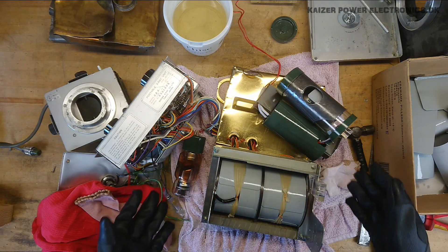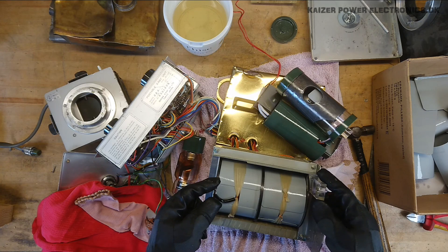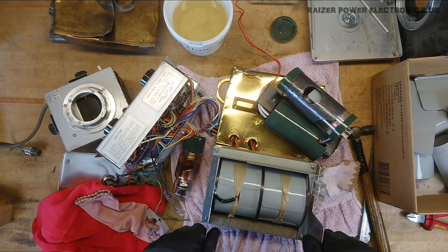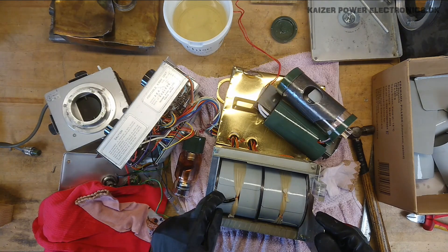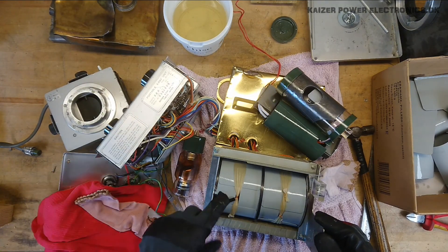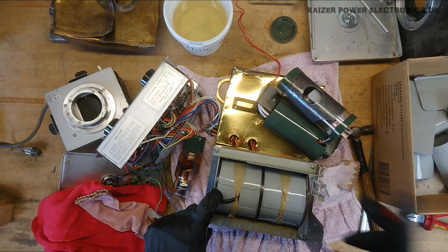I really hope you enjoyed seeing this teardown of this complete portable x-ray system from Showa. And I ended up with a nice 100 kilovolt high voltage transformer with some control logic, we can call it. So I'm happy. I hope you're happy. Until next time — see ya!